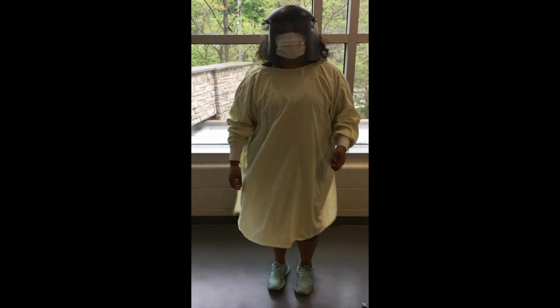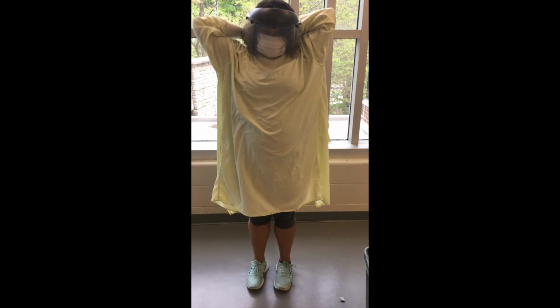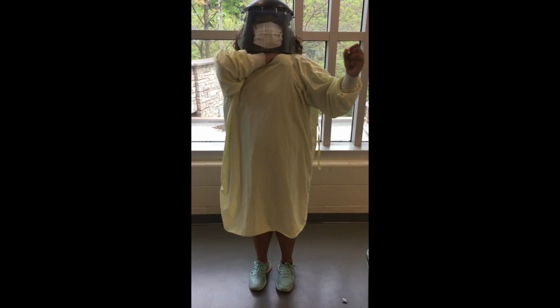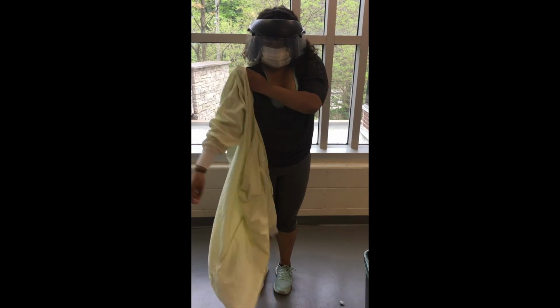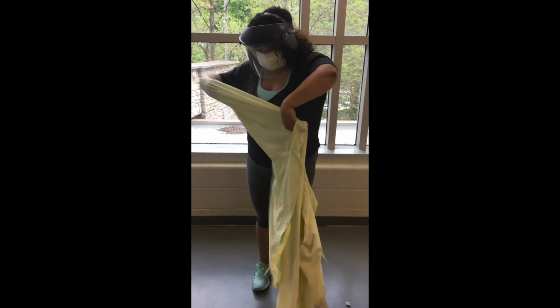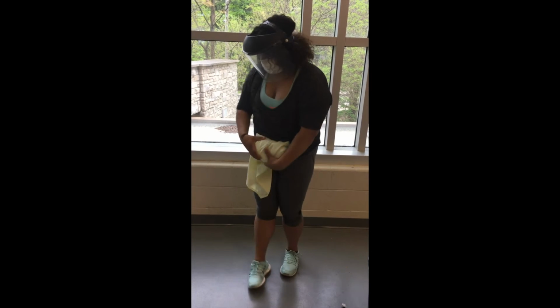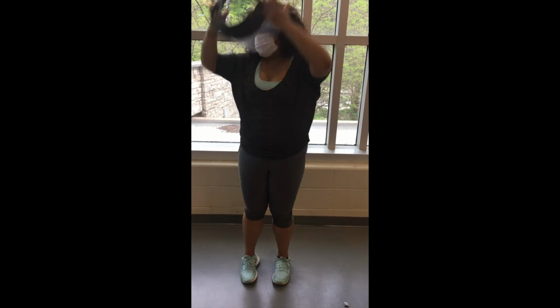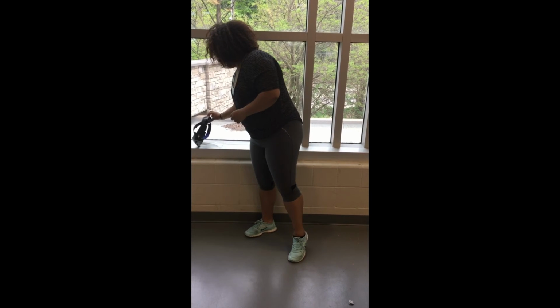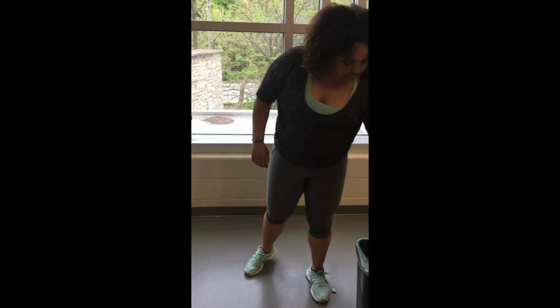And dispose of that. And after you're going to want to untie your gown and go from underneath and take it off. Same with the other side. Try not to get it onto yourself. Then you're going to roll it into a ball and put it for washing. Then you're going to remove the head mask, put that to the side, and then take off the breathing mask and dispose of it.